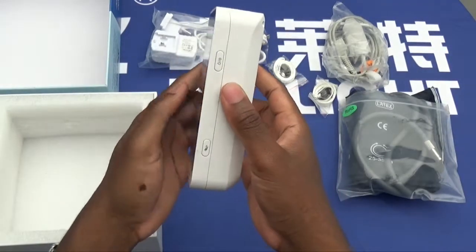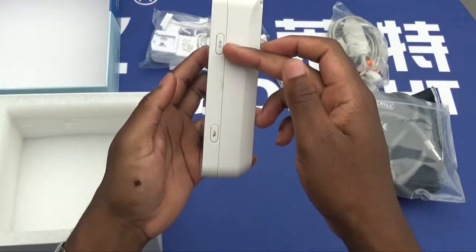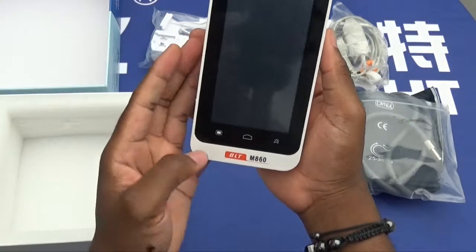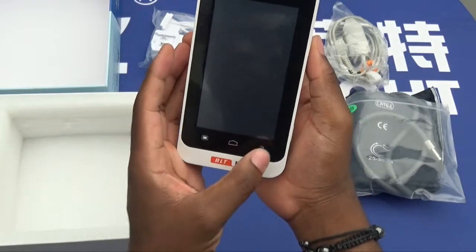Looking at the right-hand side of the device, we have the on-off button and the NIBP button. We also have the home button, menu button, and the stop button.